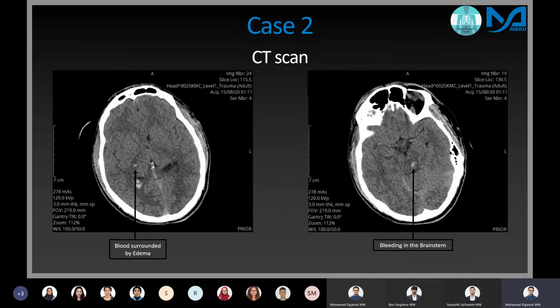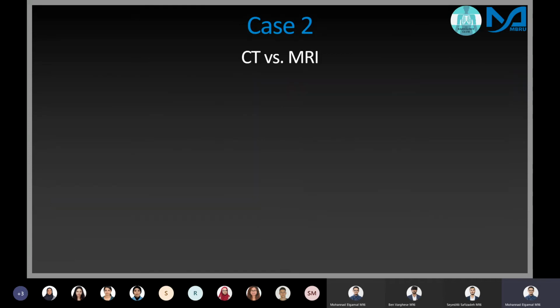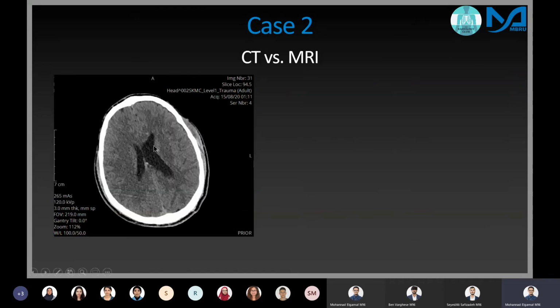able to tell. But some structures might look a little bit bigger. For example, I have another image here where I have the CT and MRI compared. Here you see that the ventricles look asymmetrical, but they're not that asymmetrical. It's more because of his head being tilted. So that's also something to keep in mind, the positioning of something like a head.